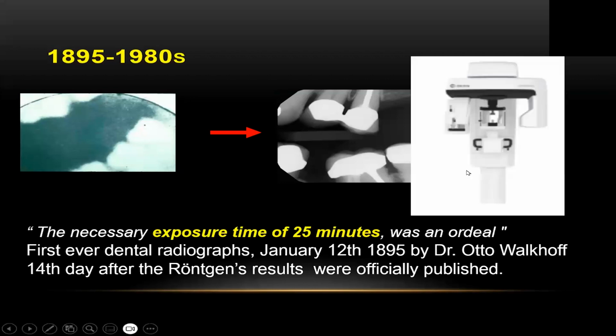And that is corrected or addressed by a cone beam CT scan.